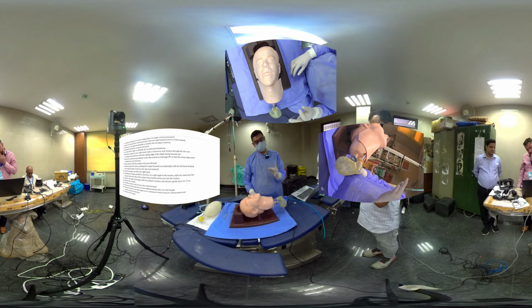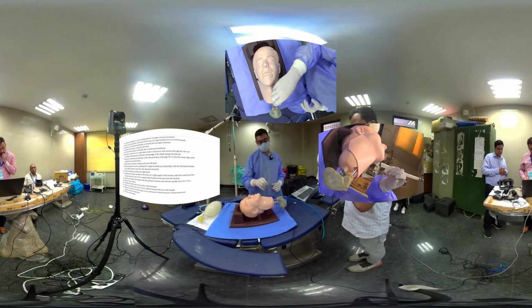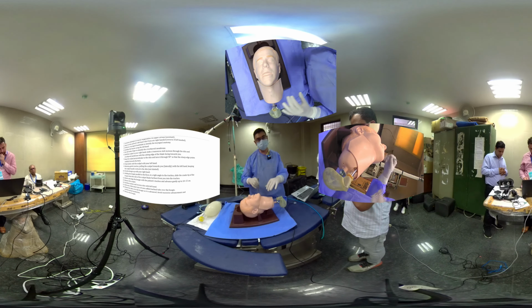Then using a scalpel, I will make a transverse incision, right? The scalpel is inserted with the blade pointing towards me. Then it's a stab twist technique. First I'll give a stab, then I'll twist my scalpel. Once I twist the scalpel, I'll retract it towards my side, then I'll insert a bougie over which I will then railroad the tube. So the proper steps we'll show you as we go.